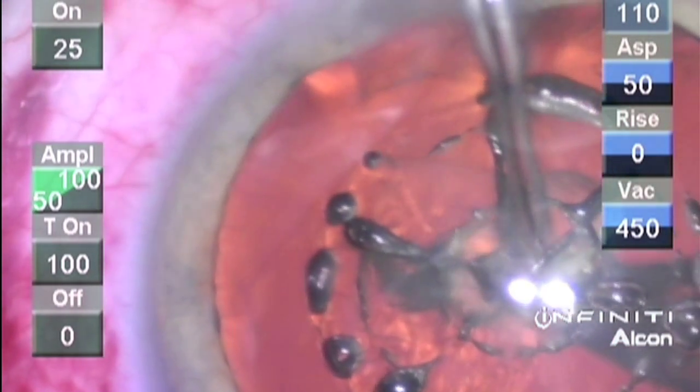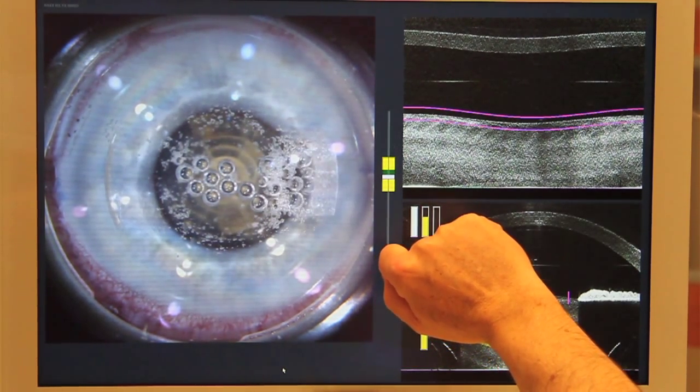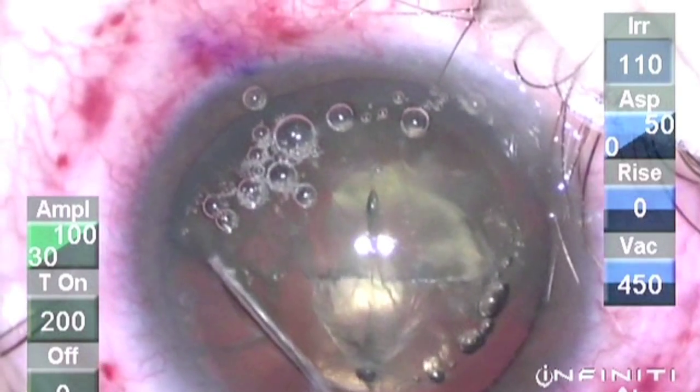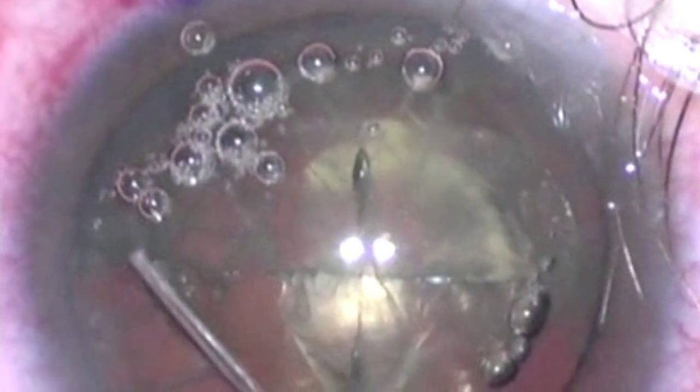These incomplete capsulotomies with tags, adhesions, or serrations create challenges of their own, particularly when a radial tear occurs, as seen in this video, where hydrodissection causes the anterior capsule to tear, seen here in the subtle pop of these bubbles near the capsule.